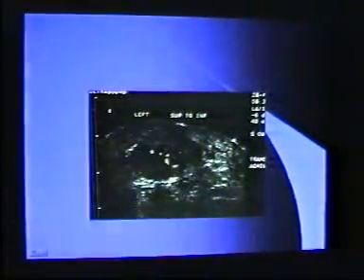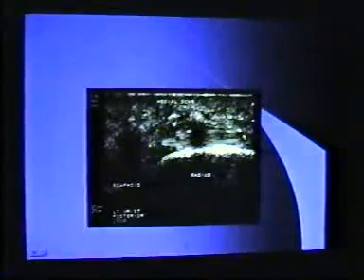Then we can assess tendon tear. We can have follow-up scans, and we can see that at follow-up the acute changed into chronic. This is longitudinal and transverse view, and we can find the tears there. Here is again a scar and a tear in the tendon.